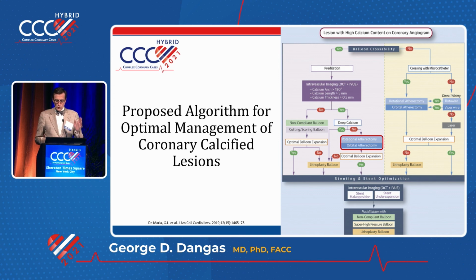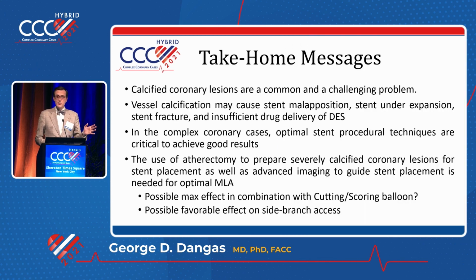We don't want to go to all these details. But in general, if you treat the calcific lesion by trying to avoid atherectomy, you're going to regret it 16% of the time, and you're going to have unfavorable or non-uniform stent expansion and insufficient drug delivery in a lot more cases. Let me leave it as such.